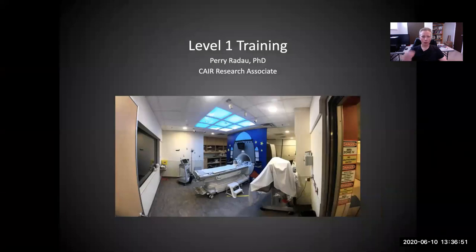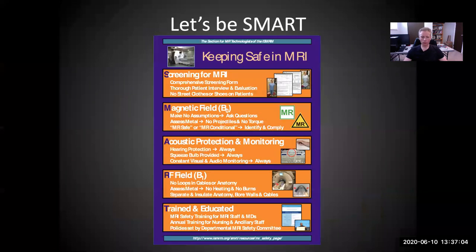Okay, so this is what our MR room looks like. It's the 3T MR magnet from GE at the Alberta Children's Hospital. Today, what we'll be talking about is how to stay safe in the MR environment.